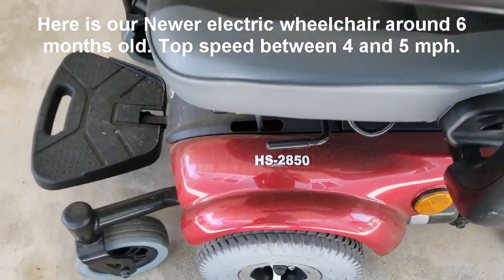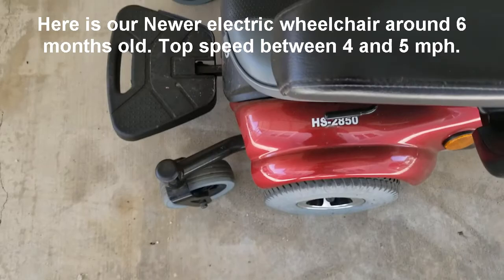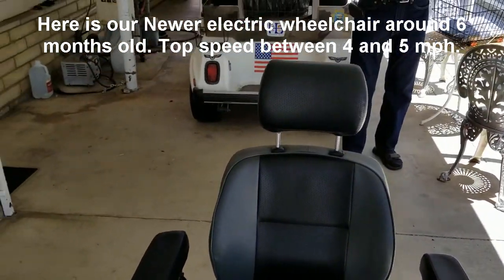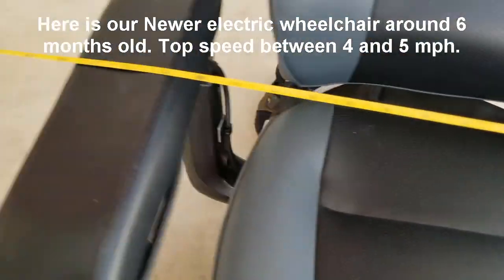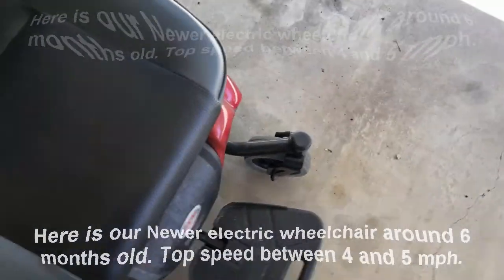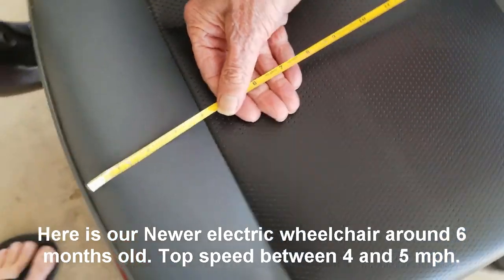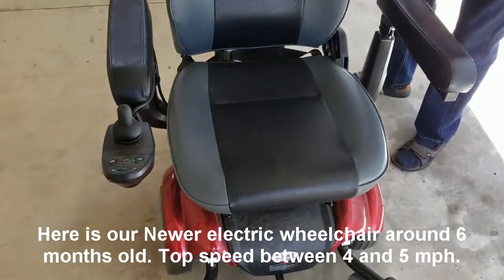We're also selling this electric wheelchair — model number HS2850. It's about 6 months old. The company that manufactures it — let's get the tape measure. It's about 28 inches wide. The maximum load capacity is somewhere around 400 pounds, and the seat is approximately 18 by 20 inches. Like I say, it's relatively new — only 6 months old, right out of the crate.